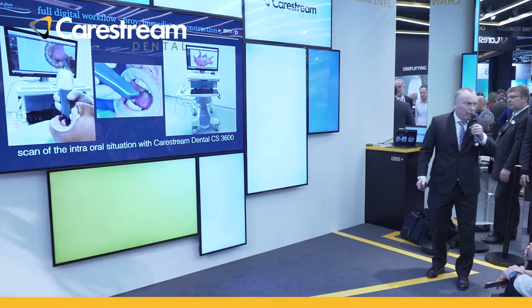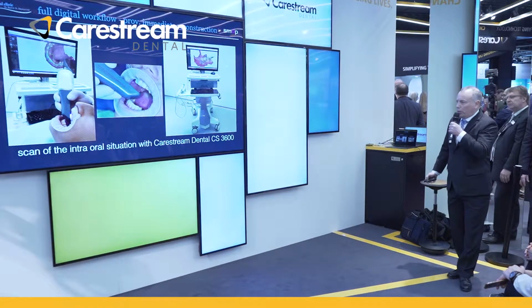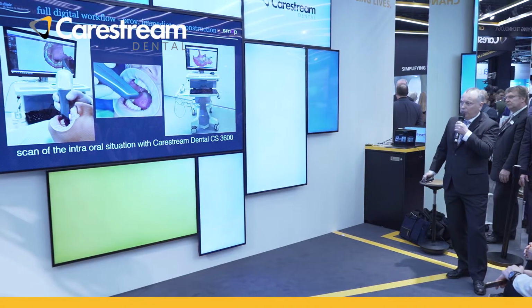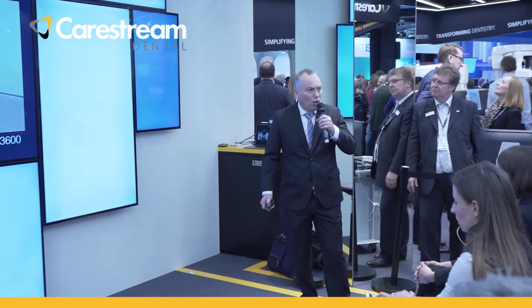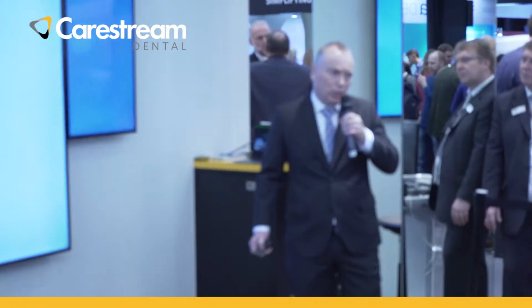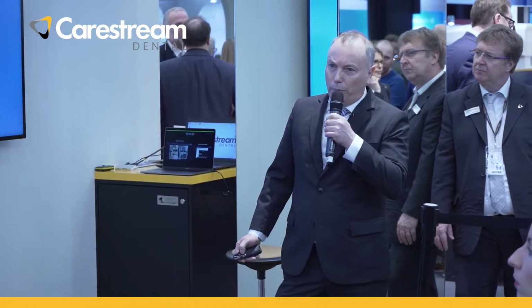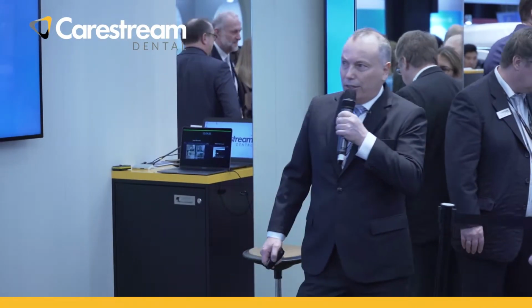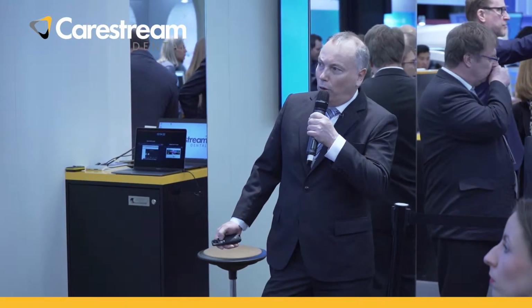The first step I did was to take a digital impression with the Carestream CS3600. In my office, we take more than 90% of all impressions only digitally. Then we took a cone beam CT. We now have the really nice CS9600. In this case, we did not take a face scan, but for bigger cases, I also do the face scan now.